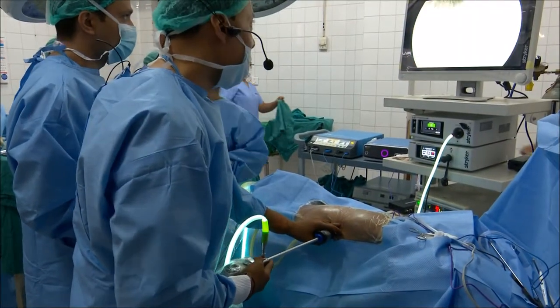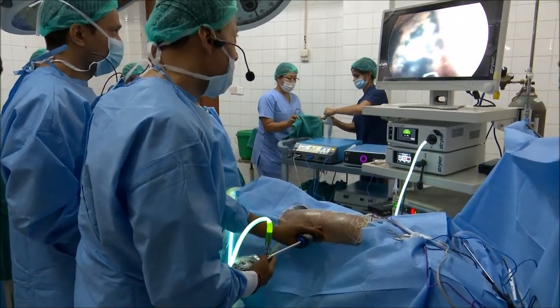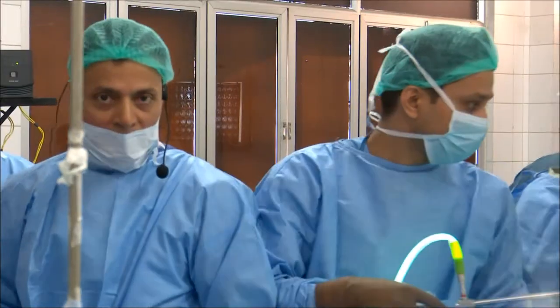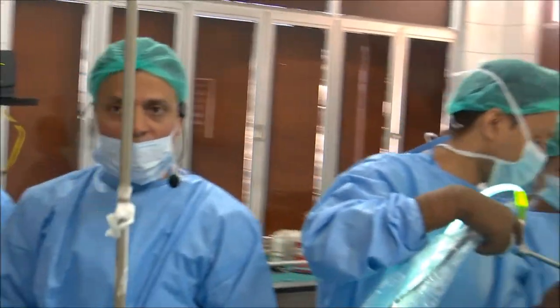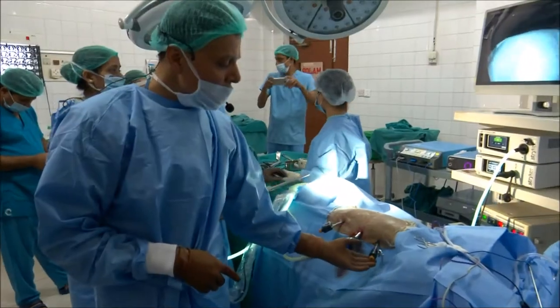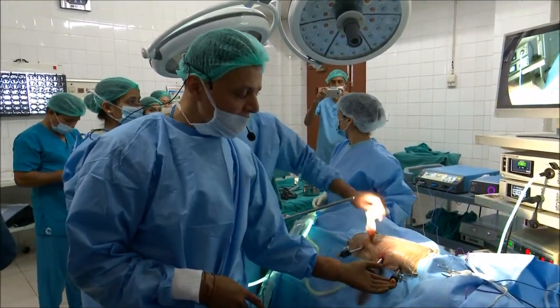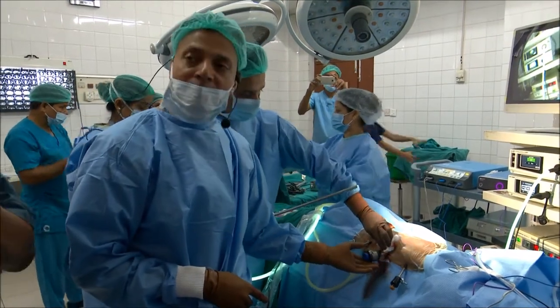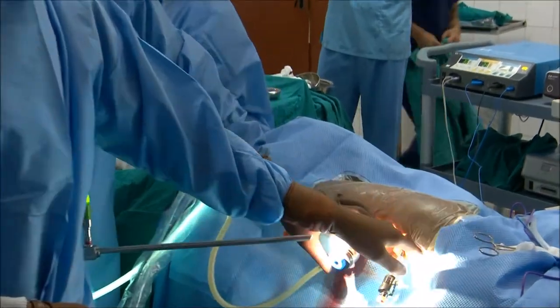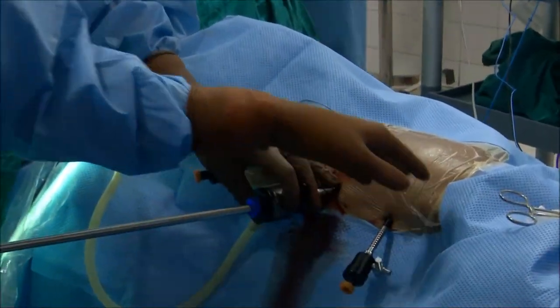You can see the lung has collapsed. You can see we have put the three ports — the 10mm port, which we are using as the optical port, and these two are the 5mm ports. This is the 5th intercostal space, this is the 7th intercostal space, and this is the 9th intercostal space. These are all approximately in the mid or posterior axillary line.